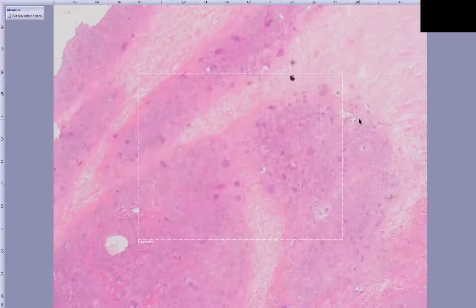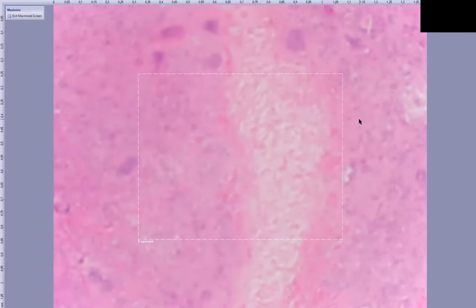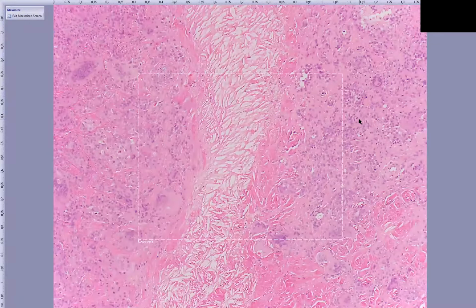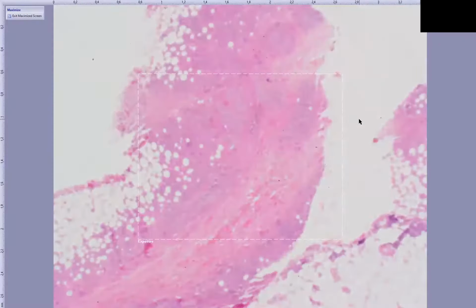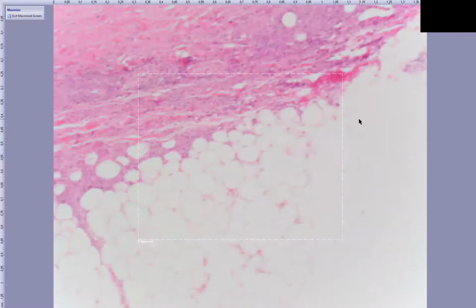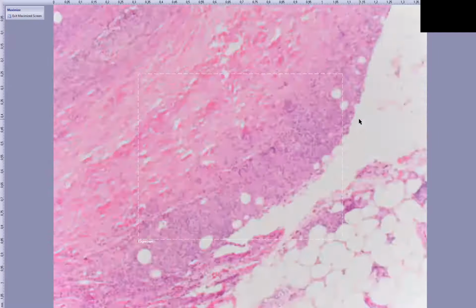And then when you look in the necrobiotic zones, recognizing the white needle-shaped clefting within those zones of necrobiosis is classic as well. You can see many plasma cells and you can see eosinophils in NXG. And I'll show you, if we go a little bit further down, where there is a little bit more of an infiltrate.